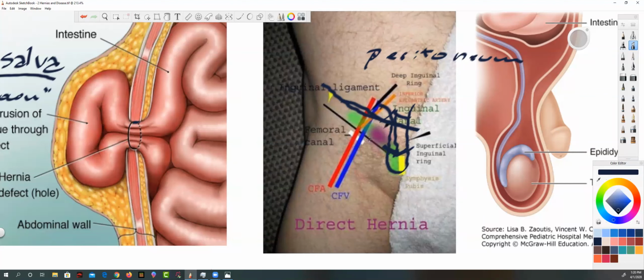If not, what I would suggest is you cine back and then take a picture as the hernia is traveling. Before the day's over, I'll definitely get some video, hopefully, of a hernia in action, so you can see what that looks like. The other possibility for this person is to have a femoral hernia traveling this way.